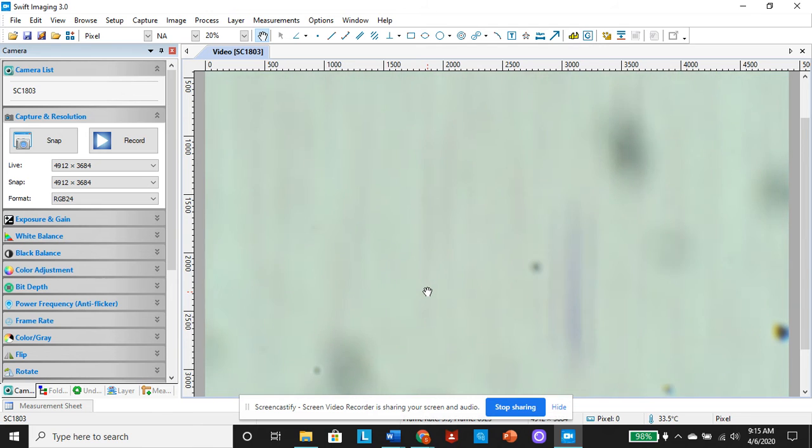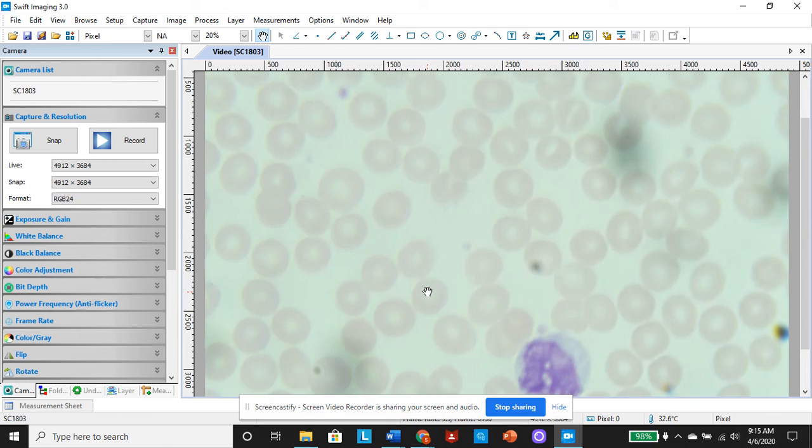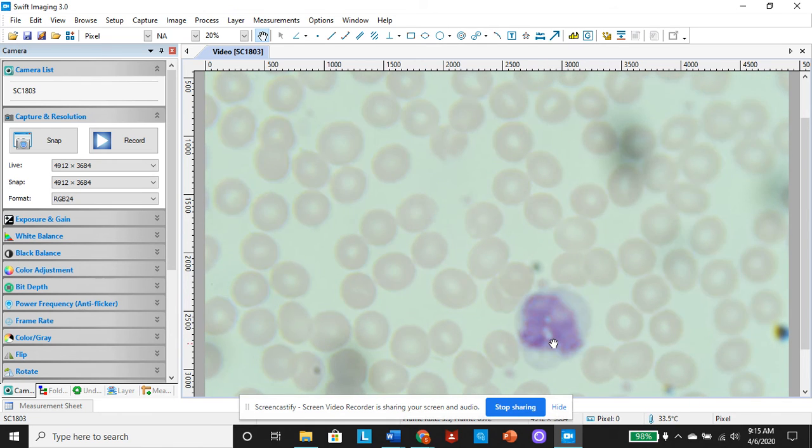Here's another neutrophil. Here's another monocyte. Ooh, hang on. Yeah, good monocyte. And you can see these white holes in it now. These are the vacuoles I was talking about. But you can see how different and how big it is, and how the cytoplasm looks different from a lymphocyte. It's like ground glass, is what they call it. It's grainy. And you see how different the chromatin is inside the nuclei. It's not as condensed, it's paler, it's not as tightly packed.